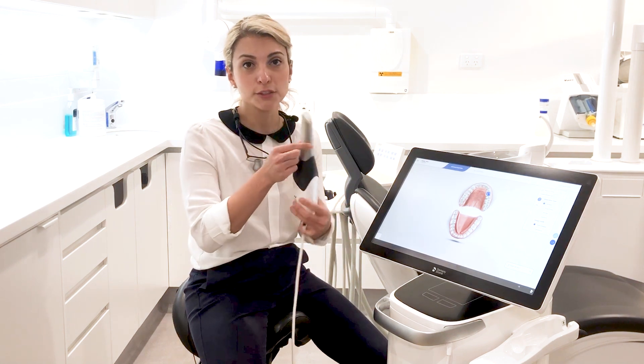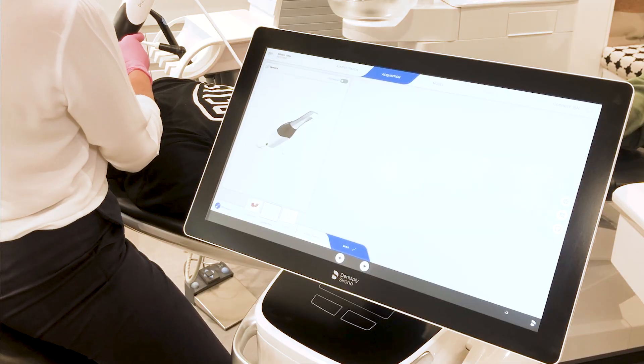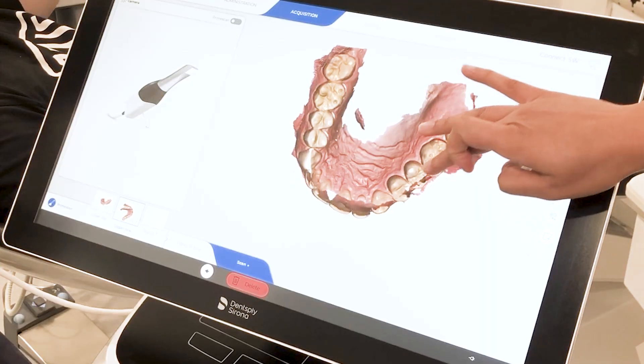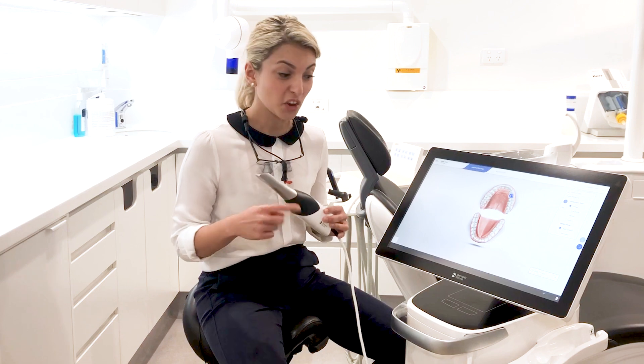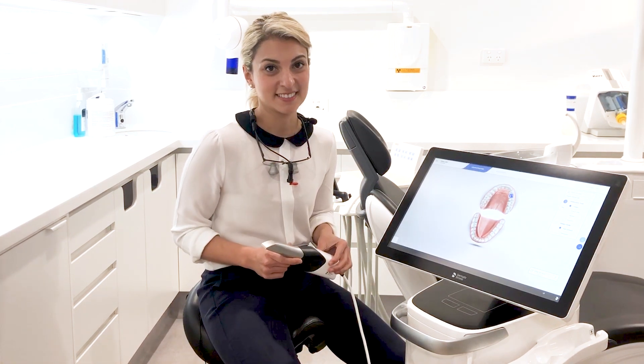So how is this scanner better? We can say goodbye to materials and it's much less invasive. So how does it work? I use this wand and I maneuver it around your mouth and I take a 3D video which gets turned into a 3D model of your teeth. Here are some fun facts: it's a smart pixel sensor and it takes 1 million 3D points per second, and then the computer processes 50,000 images per second. It's pretty cool.